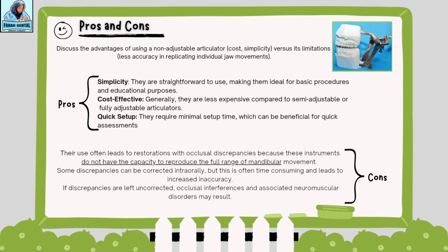In the advantages, we have simplicity, cost effectiveness and quick setups. They are straightforward to use, making them ideal for basic procedures or educational purposes. They are cost effective in that they are less expensive compared to semi-adjustable or fully adjustable articulators. They require minimum time, which can be beneficial for quick assessment.